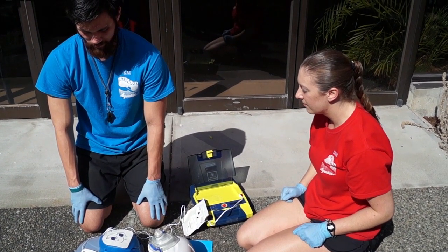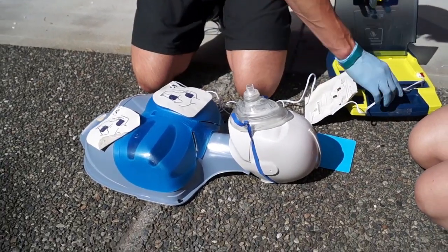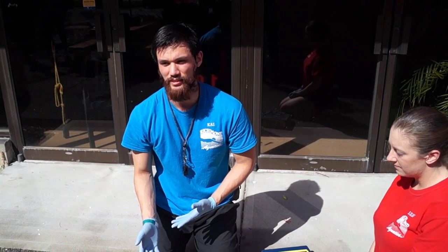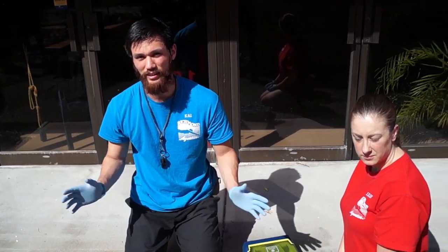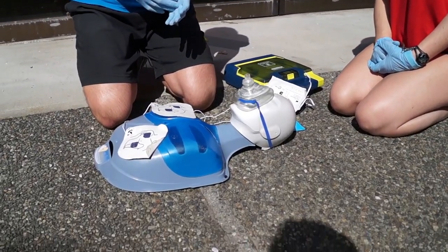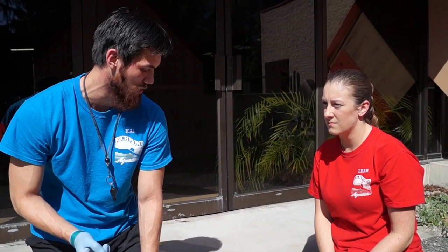Do not touch patient — analyzing rhythm. Do not touch patient — analyzing rhythm. It is now safe to touch the patient. Start CPR, give 30 compressions. This is a trainer unit so it doesn't have the shock cycle built in, but if it deems there is heart arrhythmia it will give a shock. At that point we'd back off — it would alert everyone in the vicinity to back away from the patient, shock the patient, and then cue when to start CPR again. It has a rhythm cue so you know how fast to go for compressions. It will be the same as before: 30 compressions to 2 respirations. You continue doing that until either the paramedics arrive or the AED alerts you to back away from the patient again if it deems that a shock is necessary. And that's pretty much it.